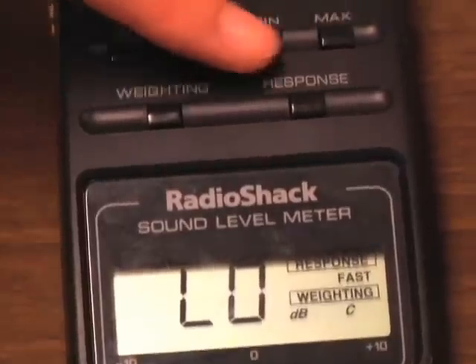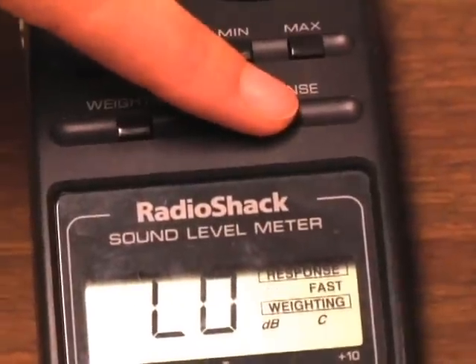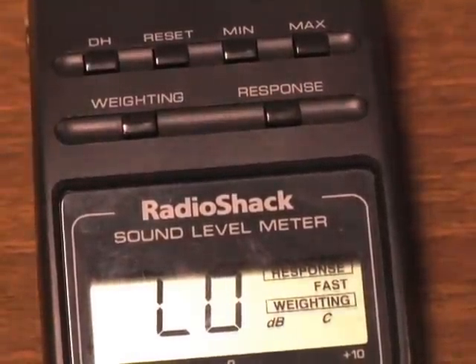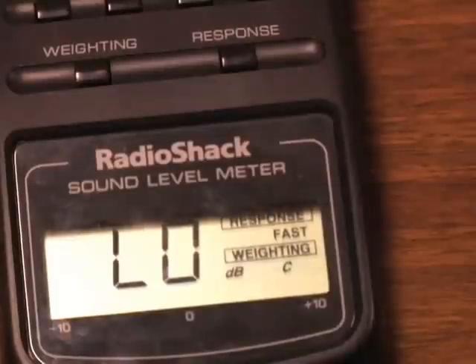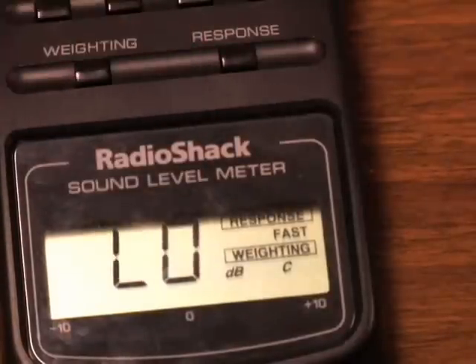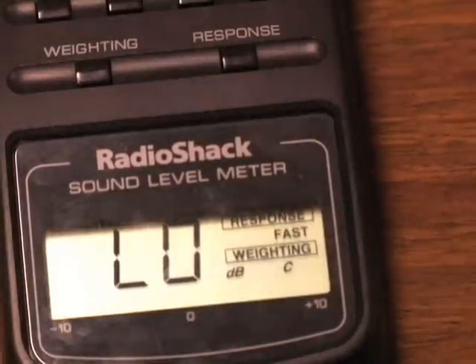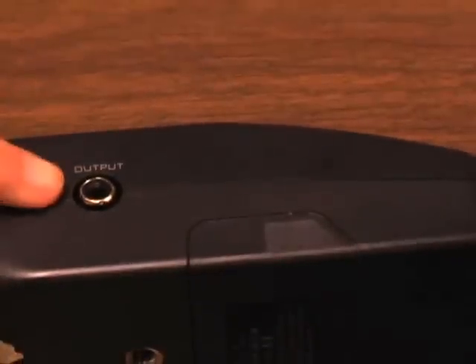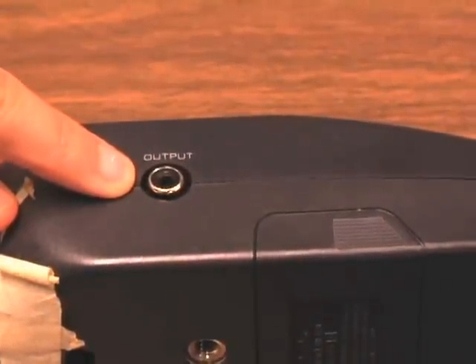The response button also allows for changing the speed of the meter's response from slow to fast. The slow response setting will make it less sensitive to rapid changes. The SPL meter also has a fast selection, which is more useful when peak sound levels are being measured, since in this mode the meter will respond to very rapid changes. It also has an output, which is an analog line output to connect it to a stereo system or a computer.